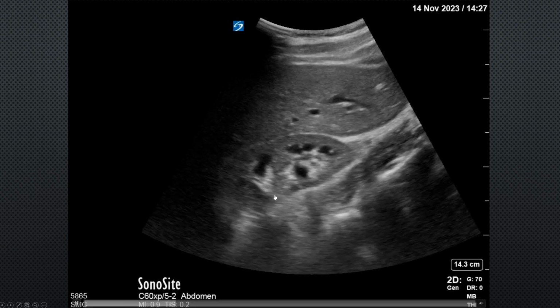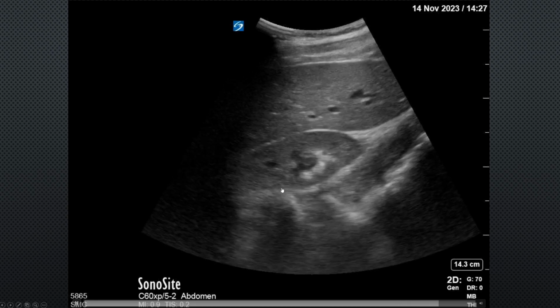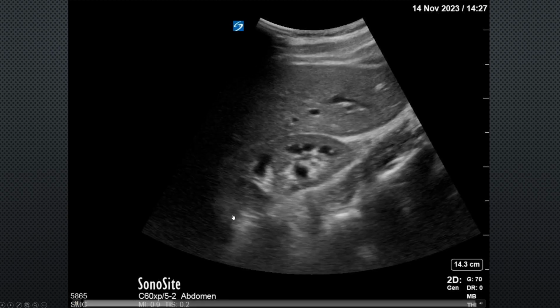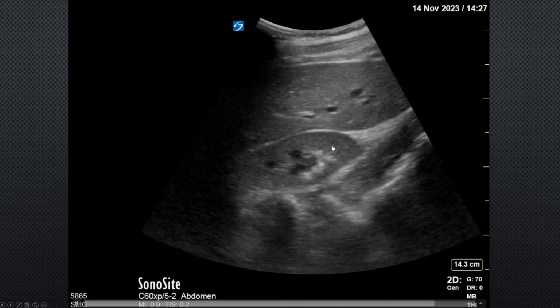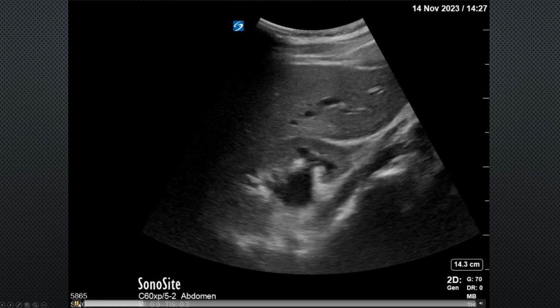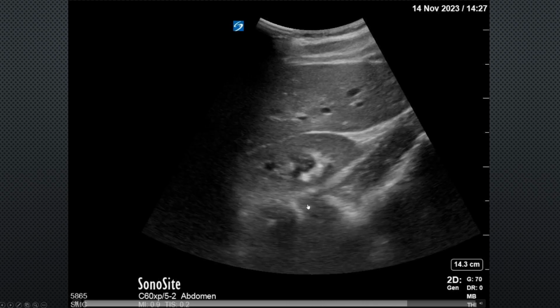So looking at some examples, this would be a right upper quadrant look at the right kidney. As we can see here, it looks like it is going definitely into the pelvis, even some into the calyces, probably even to the minor calyces. So this would likely be a grade 3, definitely in the moderate range of hydronephrosis.